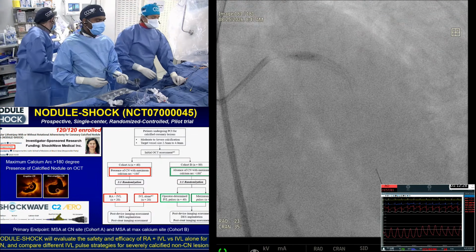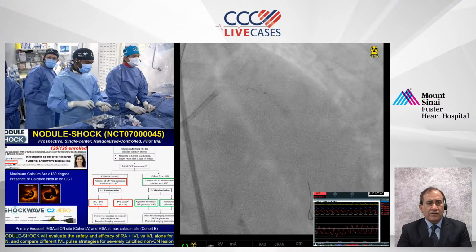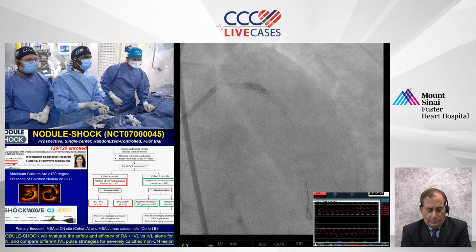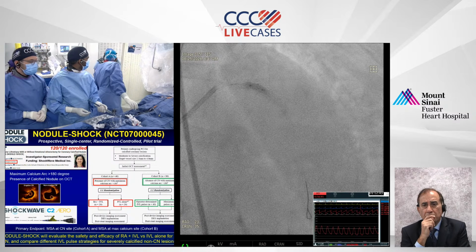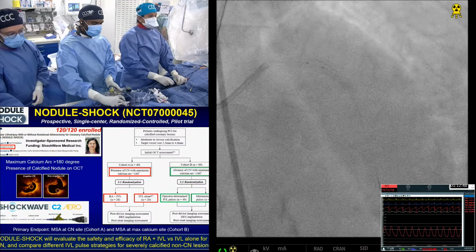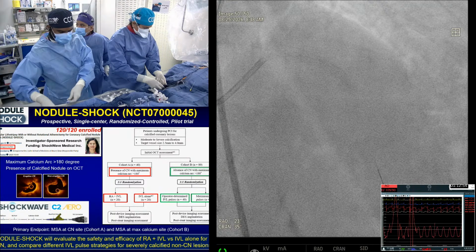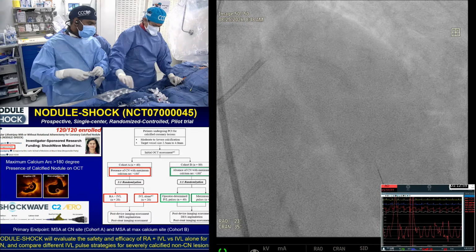If you look at just that image up there, cost notwithstanding, a dedicated pot balloon is a very good idea. Actually, in India they believe in a lot of pot, repot, and multiple times in the rooms they are using it quite a bit. Their cost is very minimal. A regular balloon is like 25,000 rupees, and a pot balloon is 40, three to four times. That's a different story. But there's still massive EKG changes.